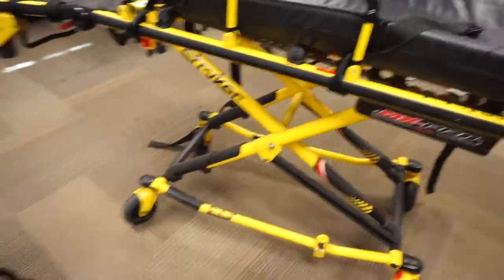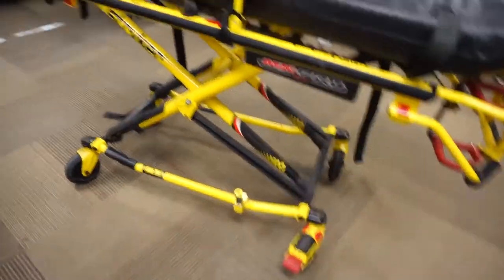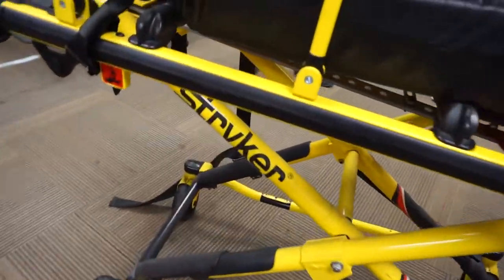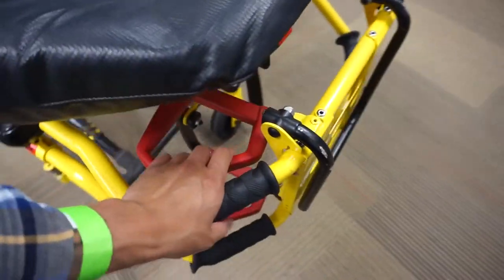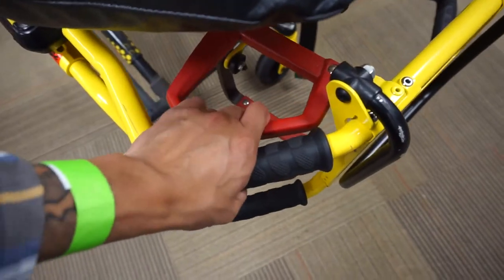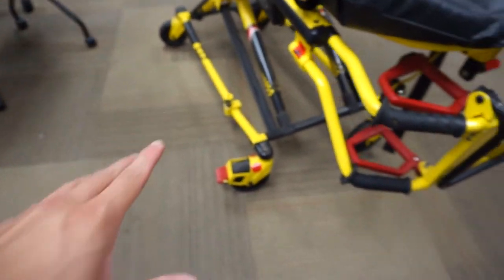Now that we're kind of warmed up, we're going to have our patient Dan hop on this stretcher. This stretcher is a little too high, but before we hop on, we're going to give a quick tour. This brand is Stryker, and everything that's red is able to articulate a piece of that stretcher. We've got the locking mechanism — it doesn't squeeze until the weight of the patient and the stretcher is off all four wheels, so that's a safety mechanism.